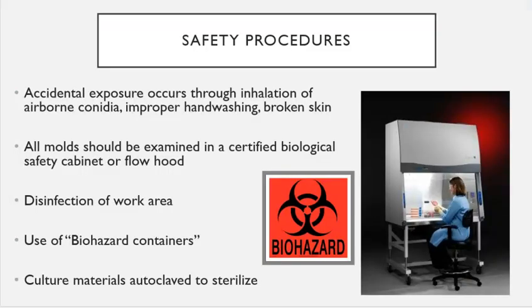First off, we want to be aware of some safety precautions or safety procedures that need to be in place when dealing with mycology specimens. A lot of times there's accidental exposure to lab techs when dealing with mycology specimens through inhalation of airborne conidia, improper hand washing, and if there's any broken skin. All molds should be examined in a certified biological safety cabinet or a flow hood. And you can see a lab tech working under a biological safety cabinet in this image.